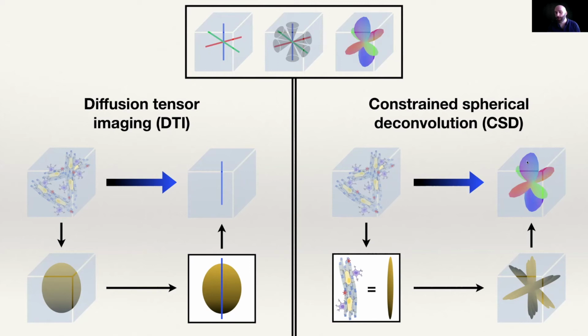And then if you do that in a complex enough way, you're going to get these ODF functions. Just to be a bit clearer, usually you try to choose a basis of functions to do that, like spherical harmonics, and then you try to combine them. So spherical harmonics of these baguette-like tensors. And then you get the ODF. With the ODF, obviously, you can also get this kind of peak thing by just taking the local maxima of the ODF. So in that case, you would get 3 peaks, actually. So it is one way to get the exact same thing you have here on the top: just take this complex object and dumb it down to 3 peaks.